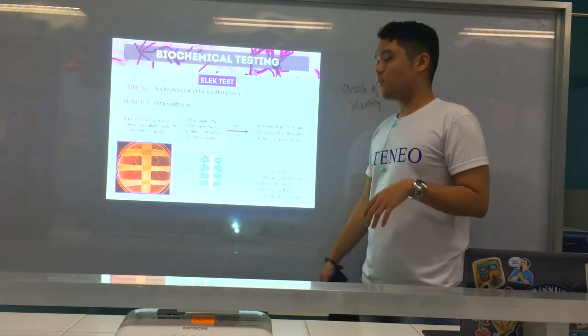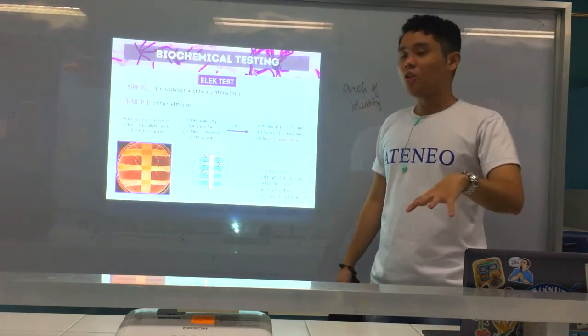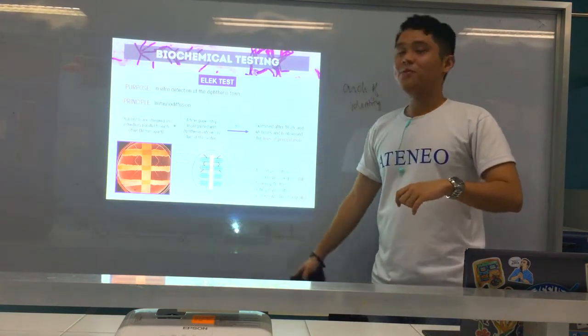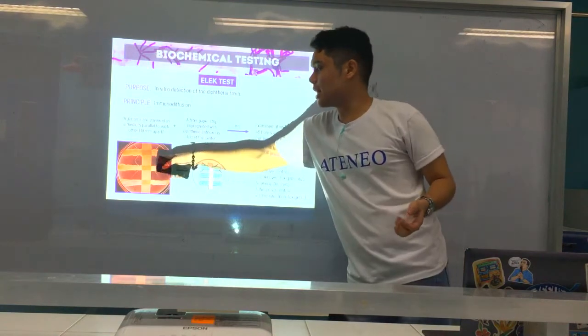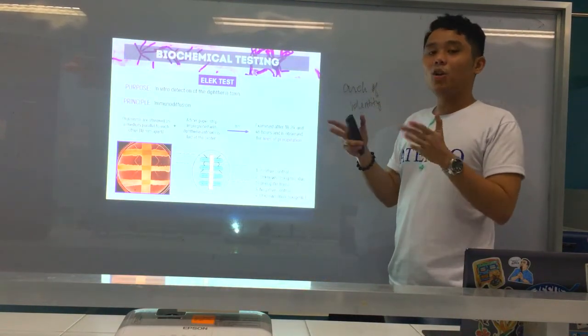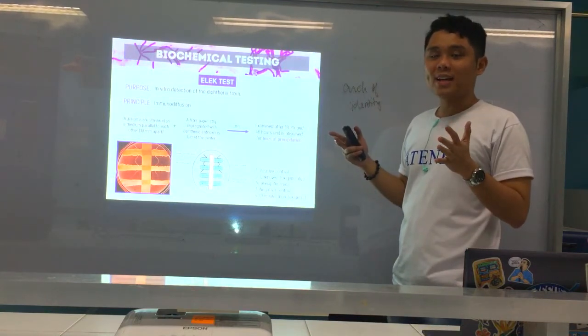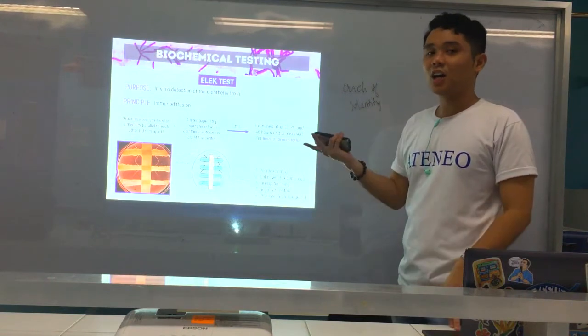Okay? Alright. And negative control, number 3, of course, walay toxin, so walay precipitin lines na makita. And number 4 is another unknown organism. If you want to detect if ni-release ba siya og toxin. And this time, wala man. So therefore, it's negative for the toxin. Combine sila. This is again the arc of identity, which means similar ilahang toxin kay ni-combine man. Okay? So they are of the same reaction.